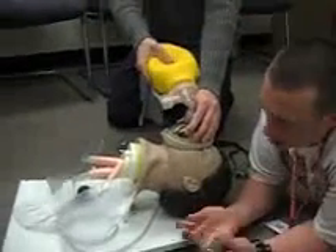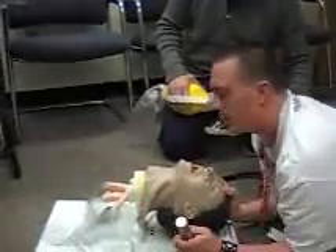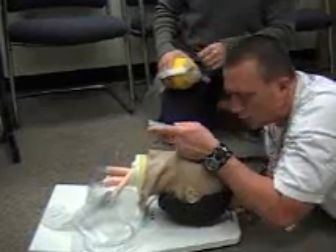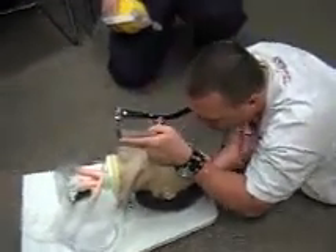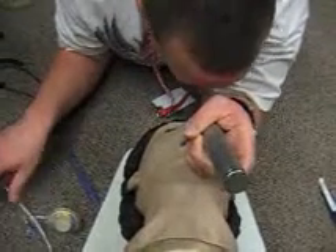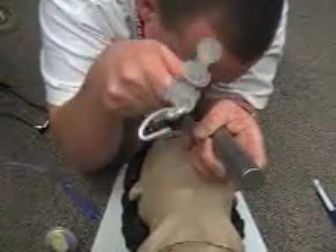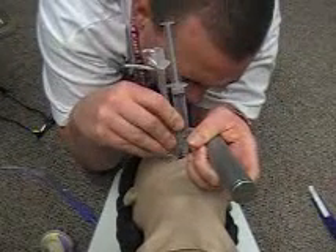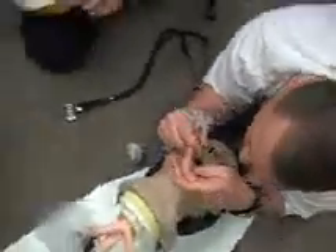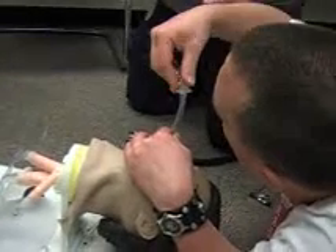Now prepared to intubate. I'm going to have my partner stop and remove the OPA, extend the patient's neck. Going in from the right, sweeping to the left — the Macintosh blade goes into the vallecula, raising the epiglottis to visualize the trachea and the vocal cords. I take my tube, visualize it going through the vocal cords into the trachea, watching the black line pass. I am 21 at the teeth. I inflate my cuff and remove my stylet.